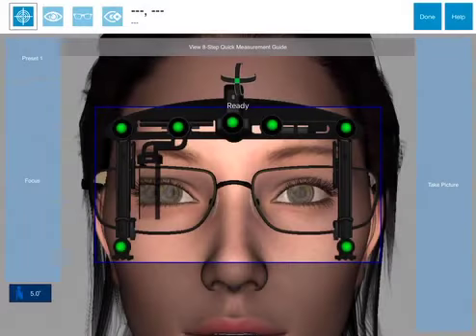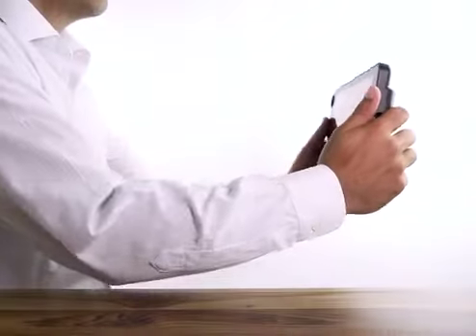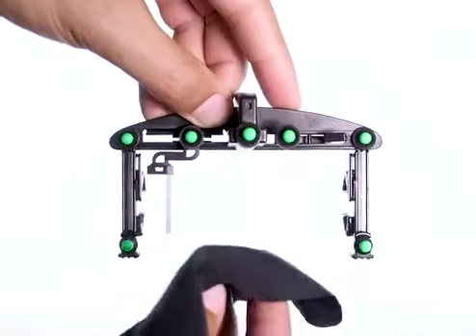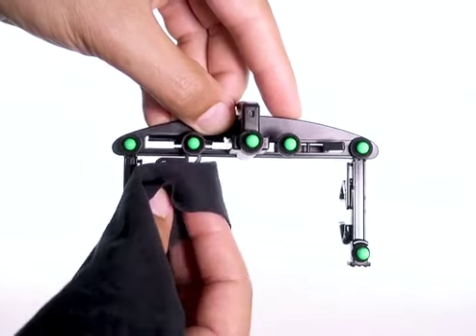Tip: to avoid blurry pictures, hold the Take Picture button pressed, adjust the iPad position, and release the button when ready, or alternatively, rest one elbow on a surface when taking the picture. If you experience excess glare, clean the eyewear lenses and prism with a cloth.